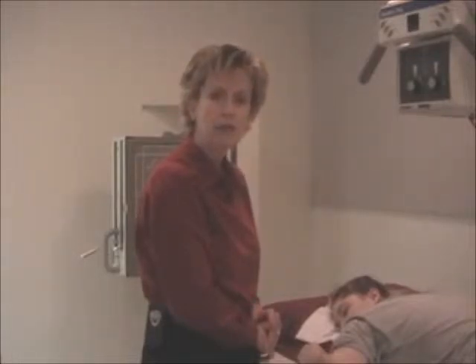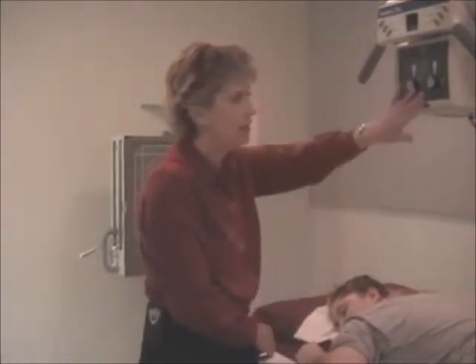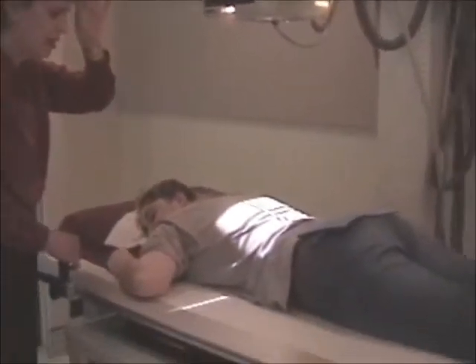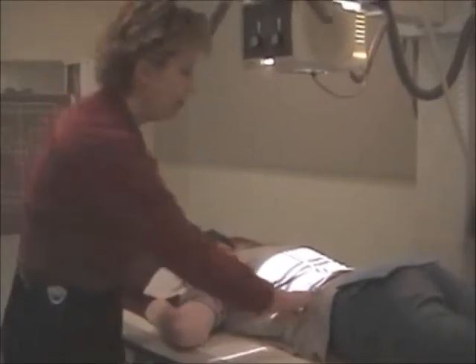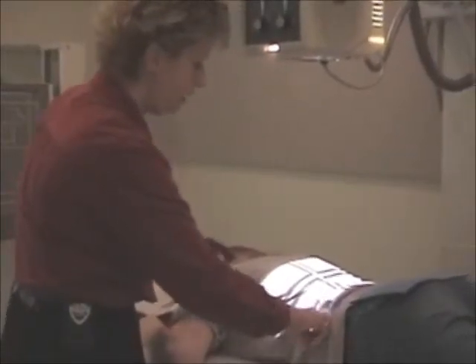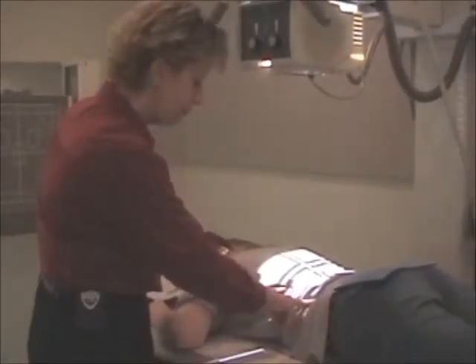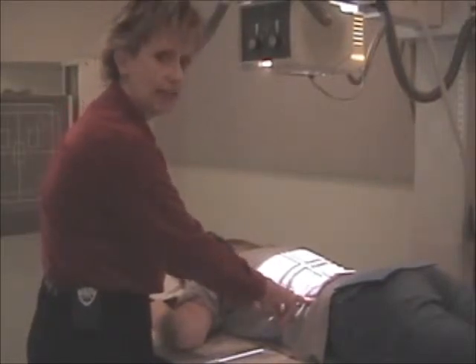You've got average, you have above average, you have slightly below average, and then you have tiny. Okay, let's focus on Kristen's back because it's really easy to demonstrate on a PA what we would do for the various body habituses. Again, this is a sthenic setup. You've got the tip of your scapula, your iliac crest, and you're halfway. Well, if Kristen was overweight, she would be considered hypersthenic.